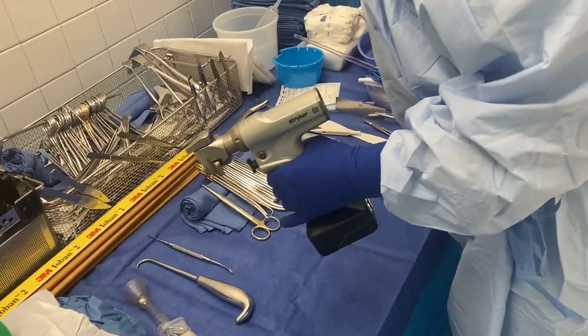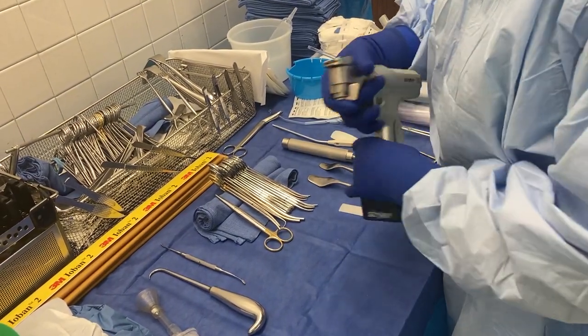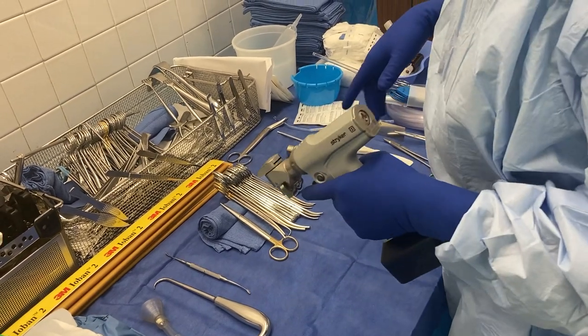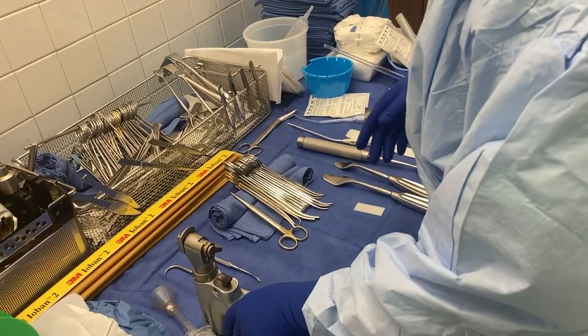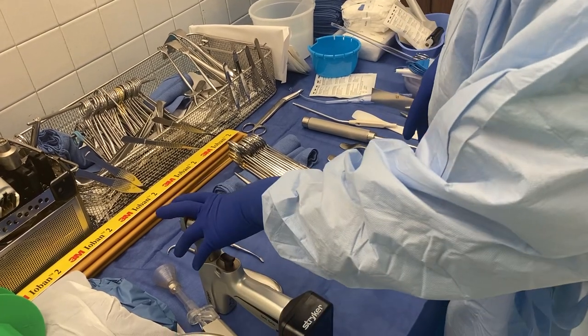We'll put the oscillating saw in and they'll use irrigation while cutting the bone so that the bone doesn't get too hot, because if the bone gets too hot it can actually die. So we want to make sure that we are irrigating really well while they're sawing through the bone.